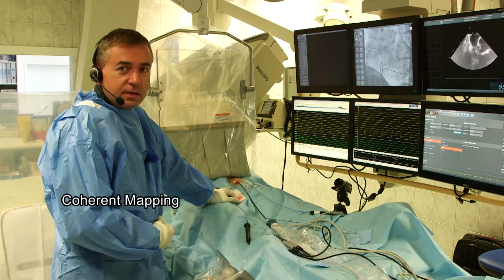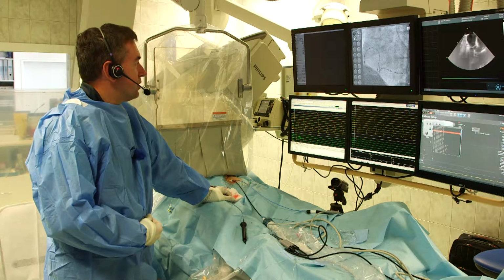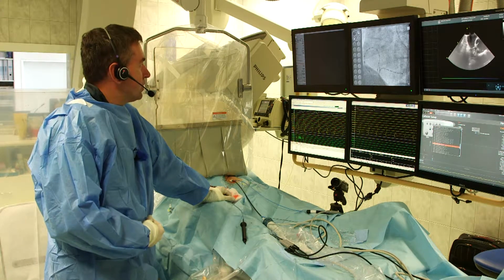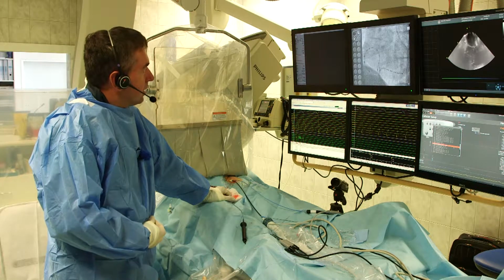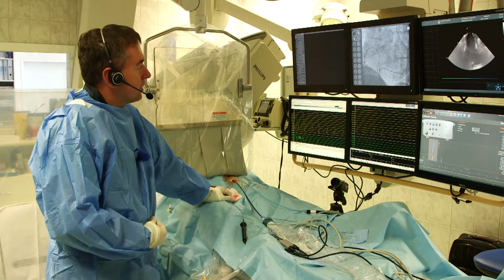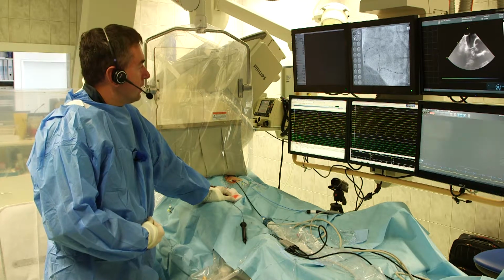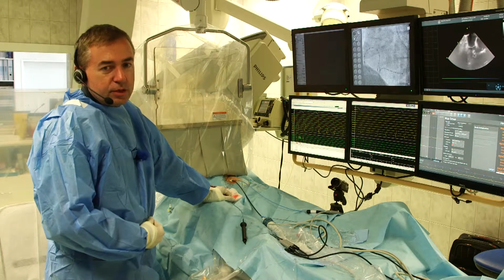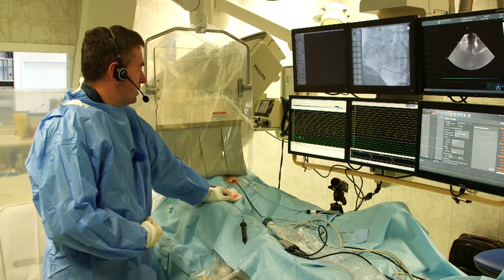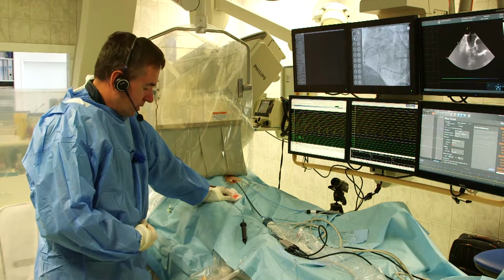Our next case is a patient after an epicardial thoracoscopic radiofrequency MAZE procedure. This patient presented to our clinic with repetitive, long-lasting paroxysms of atrial tachycardia. He was even cardioverted several times, but always with early arrhythmia recurrence. Atrial tachycardias led to arrhythmia-induced cardiomyopathy with clinical signs and symptoms of heart failure, including severely depressed left ventricle ejection fraction, which normalized during the period of normal sinus rhythm.